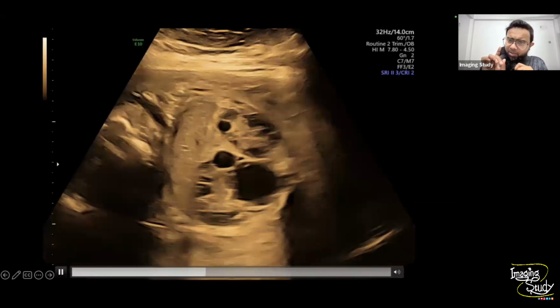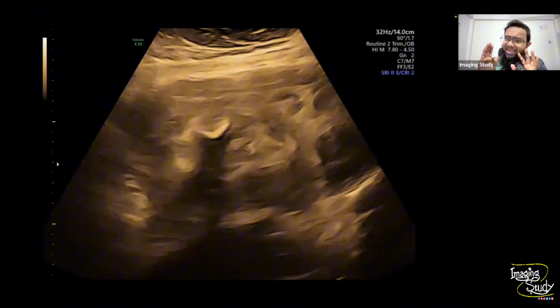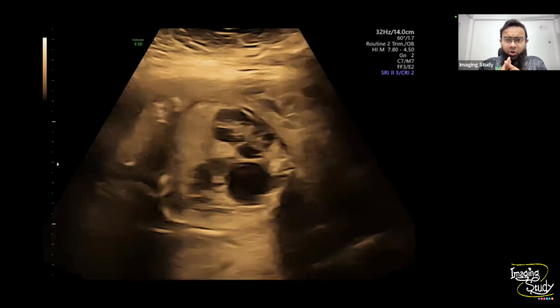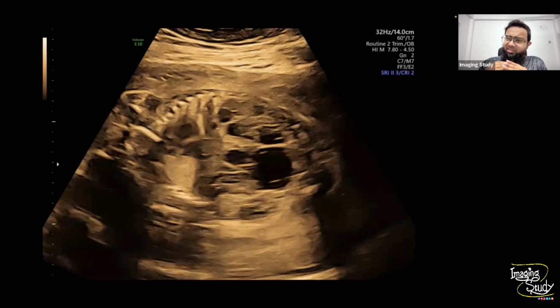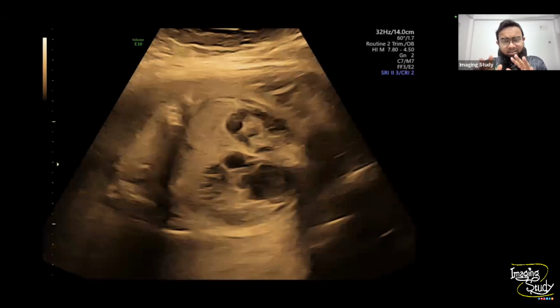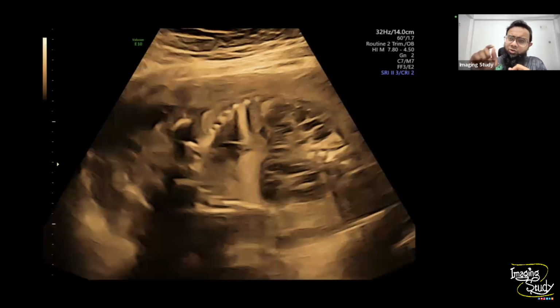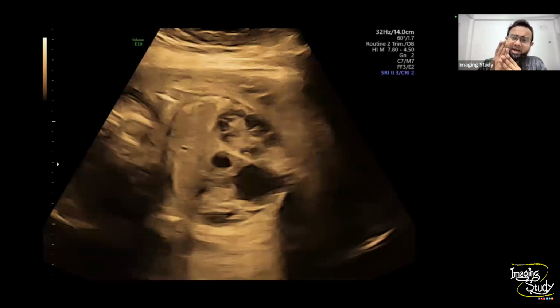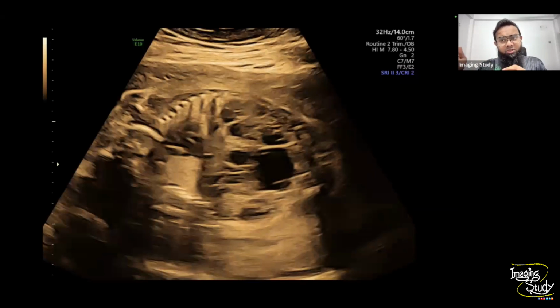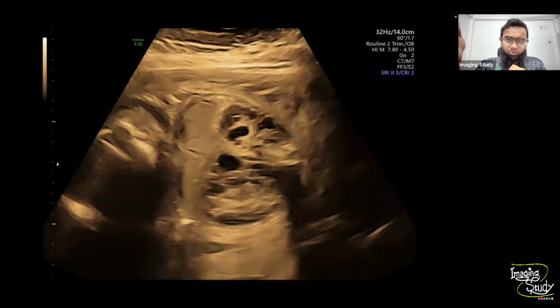We make a simple or maybe a big mistake in this situation. Whenever you see an enlarged kidney with a diffuse cystic appearance, this is not autosomal recessive polycystic kidney disease. In autosomal recessive polycystic kidney disease, in the gestational period, you won't see any cystic spaces. These are microscopic cysts, so you have to go for a biopsy, then under the microscope you can see them. There is presence of fibrosis and fibrotic bands and some tiny cystic spaces on microscopy.